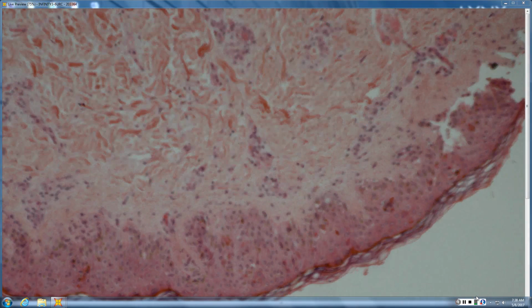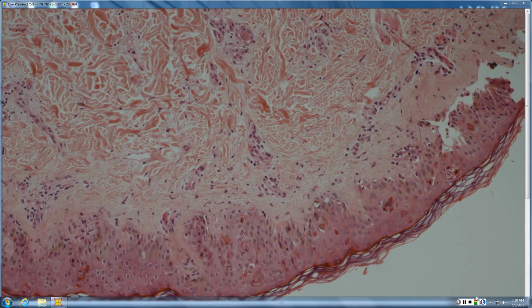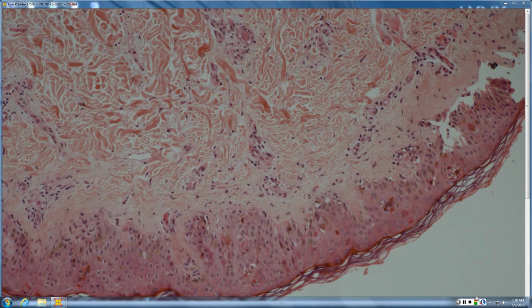Okay. We were wondering in this peanut gallery about GVHD. GVH definitely belongs in that differential. Things that might be a little different for GVH: a little more background epithelial disorder and atypia. Here, when you look at the nuclei, they're really pretty bland and uniform. A little more atypia maybe as chemo effect in the background of GVH.